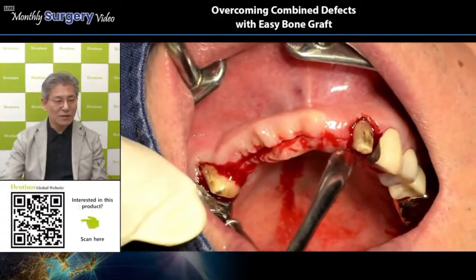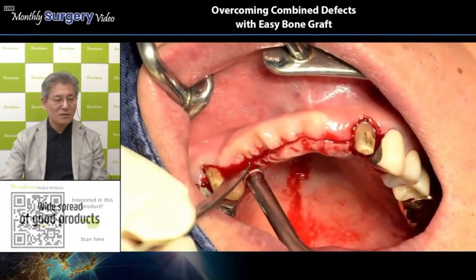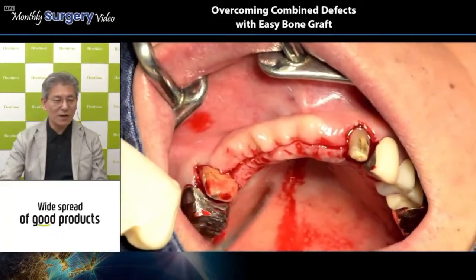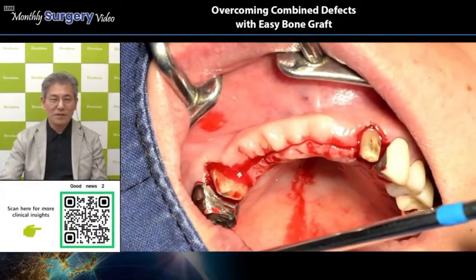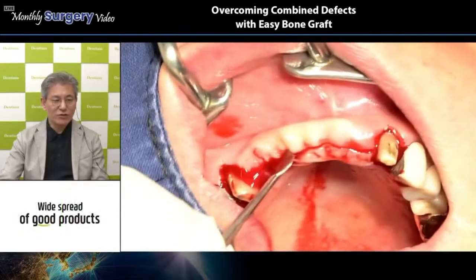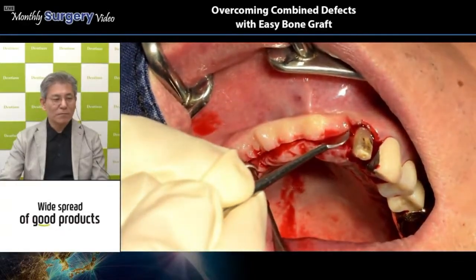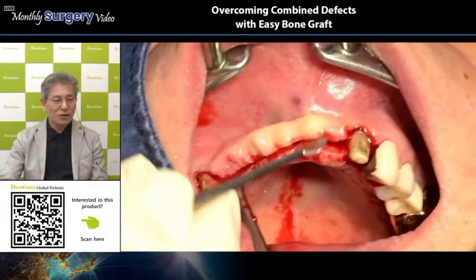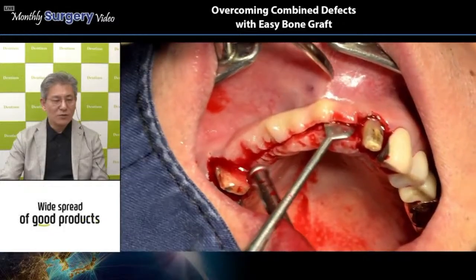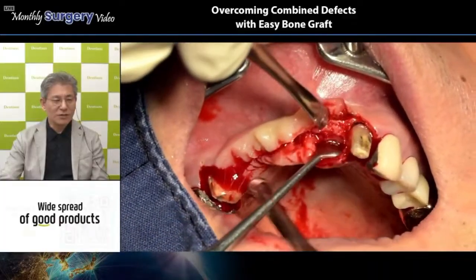Generally speaking, as you know, the palatal flap is thicker than the labial. So if possible or if necessary, you can use this slightly thick palatal flap. If you want to have a connective tissue graft, you can harvest soft tissue from this palatal soft tissue zone. Now, a round-shaped curette was used for elevating and retracting the labial side flap.